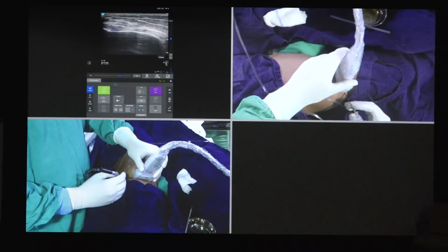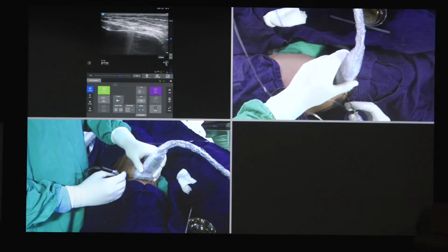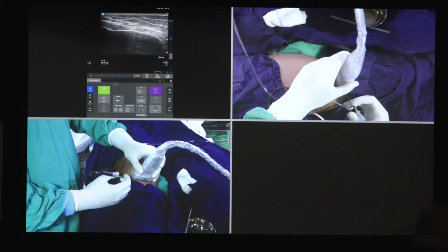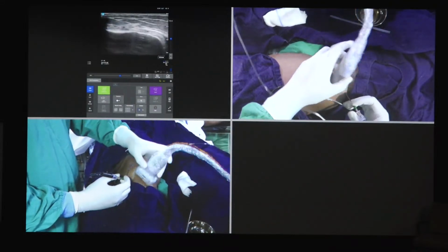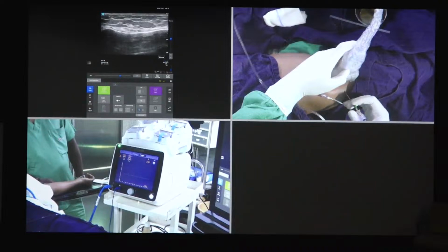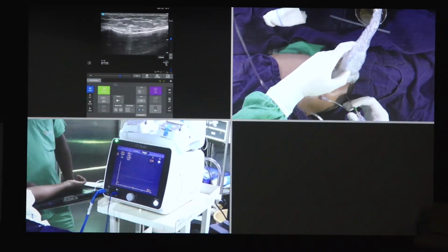So after you insert the cannula, the electrode, make sure you recheck the position, because sometimes it is prone to move, and I think I'm at the correct position. So I think we'll start the lesioning. That is exactly at the junction of the shaft and condyle, near the pulsation. Yeah.